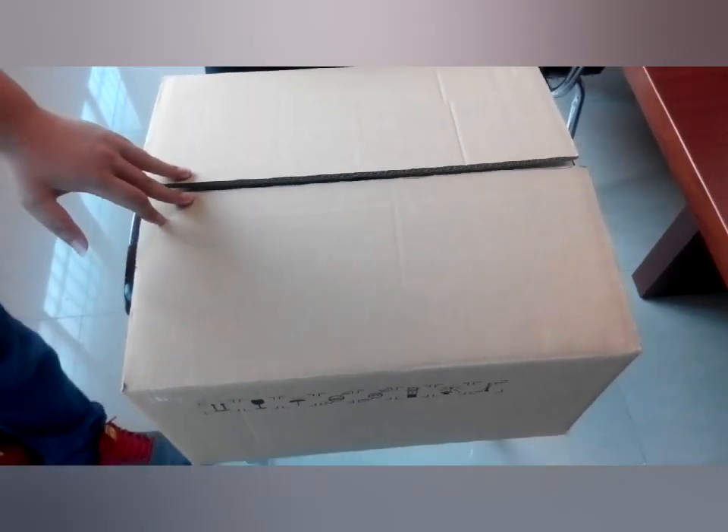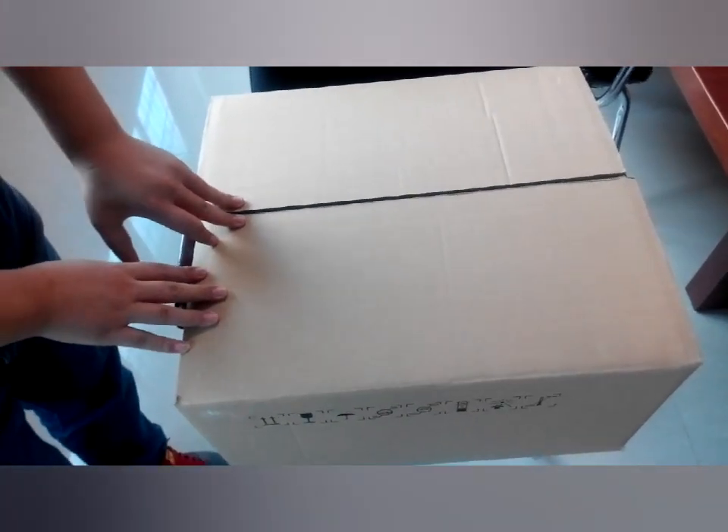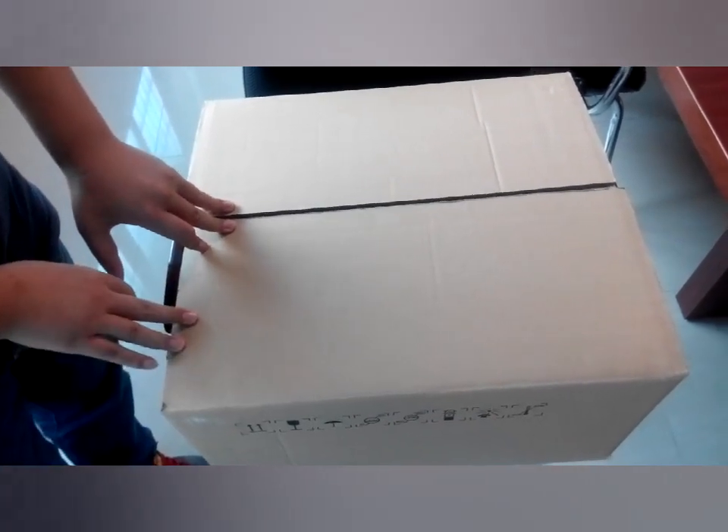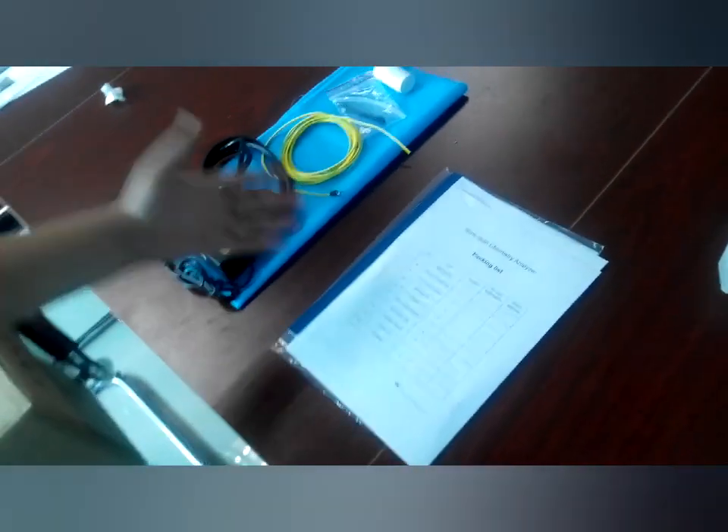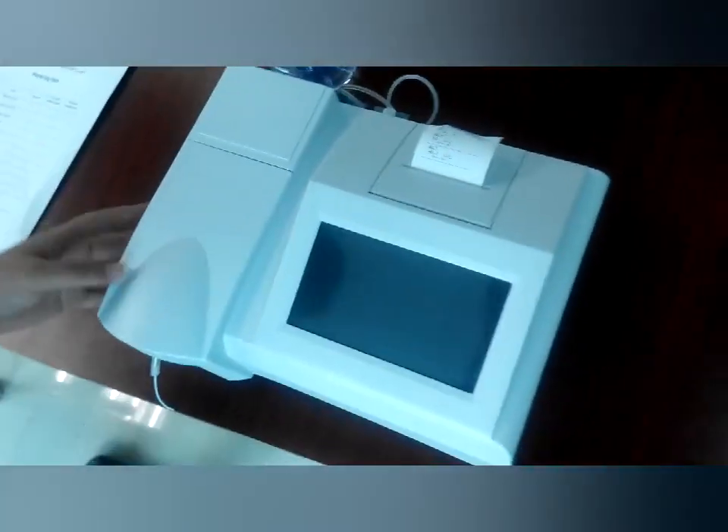First, after you get this carton, you should check if it is damaged or not, then open it. You will find the spare parts, documents, and the machine.